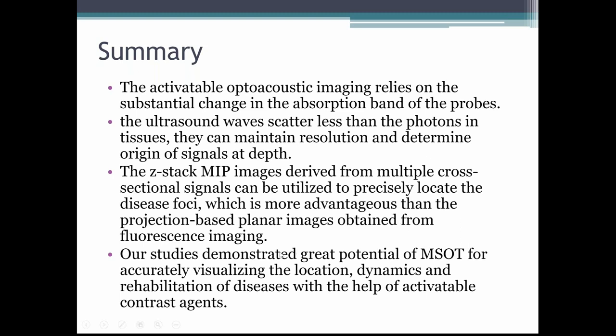And our studies demonstrated great potential of MSOT for accurately visualizing the location, dynamics, and rehabilitation of diseases with the help of activatable contrast agents.